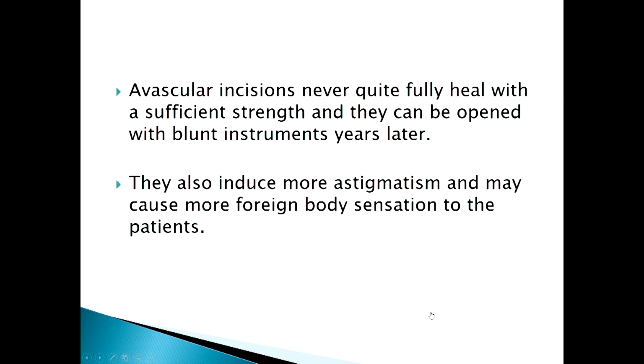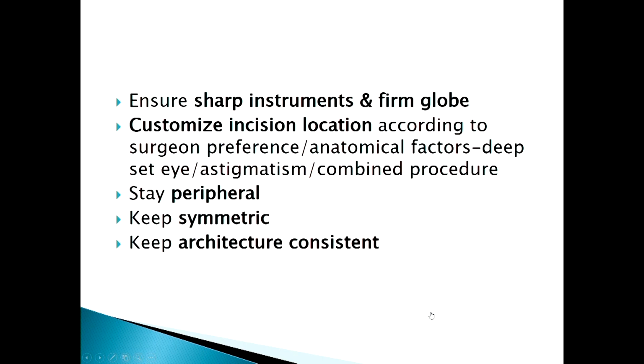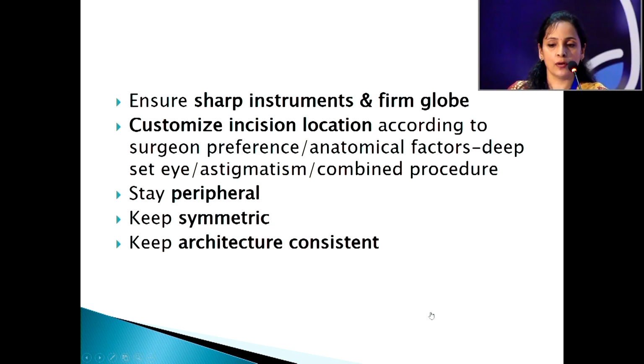So the take-home messages are that an avascular incision will never quite fully heal, and it can be opened years later with a blunt instrument. They also cause more astigmatism and more foreign body sensation. So always ensure, before you begin, that all your instruments are sharp and the globe is firm.